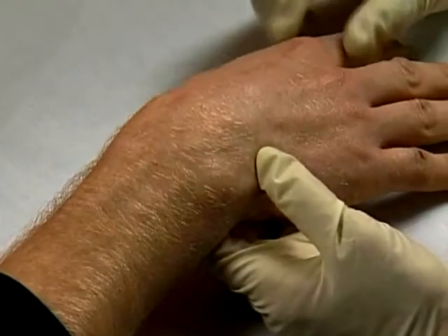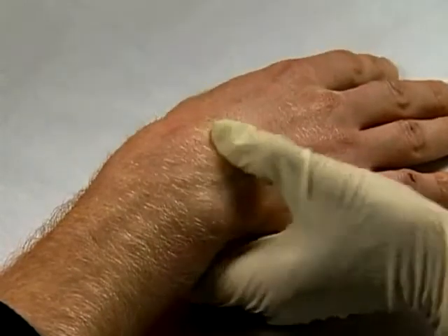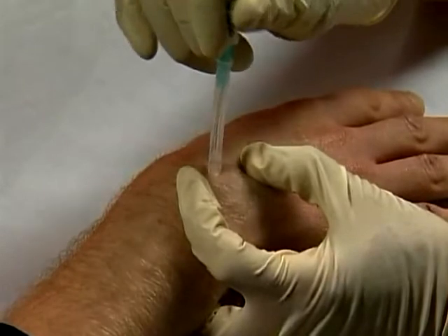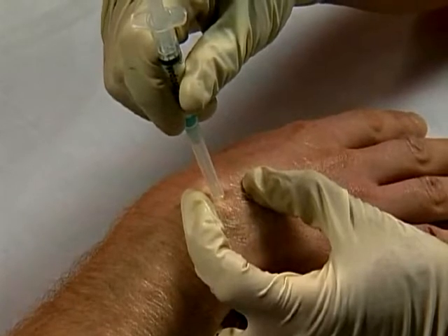Place wrist in a slight degree of flexion and palpate the capitate-lunate joint line. Mark entry point, clean and firmly stretch skin, and rapidly insert needle perpendicularly. Aspirate and inject different parts of the joint spaces as several boli.